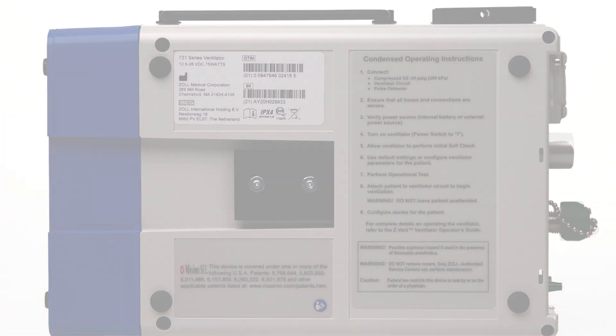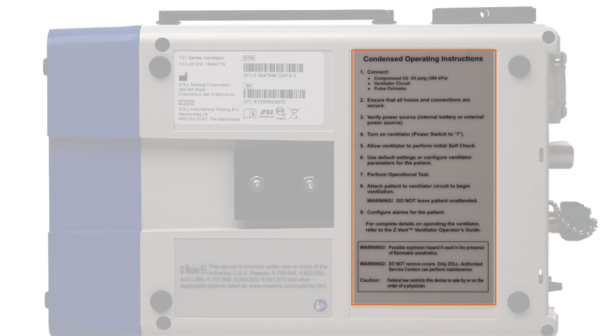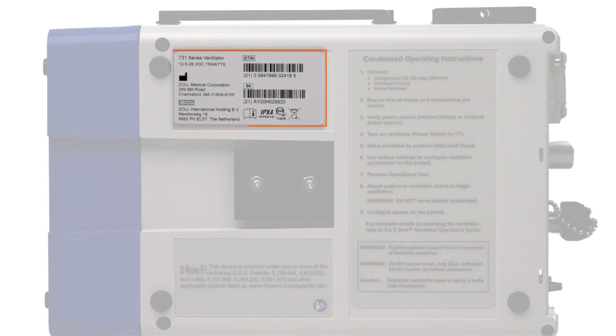Now we will look at the back of the device. On the right side are the condensed operating instructions designed to provide a quick overview on how to prepare the ventilator for patient use. At the top left is the serial number and other device specific information should the user need it for registration, tracking, or warranty purposes. Contact information for technical support can be found in the operator's guide or on zoll.com.